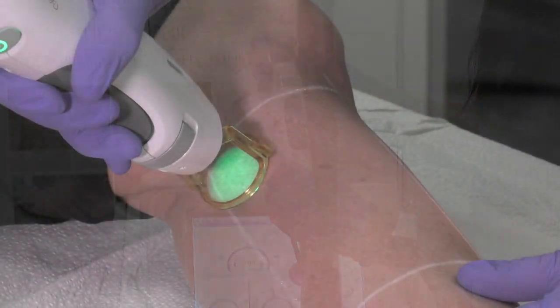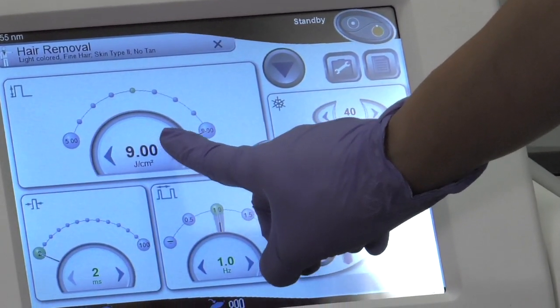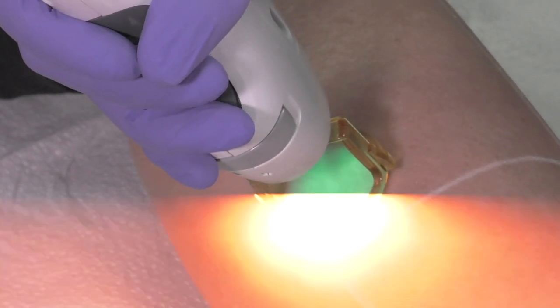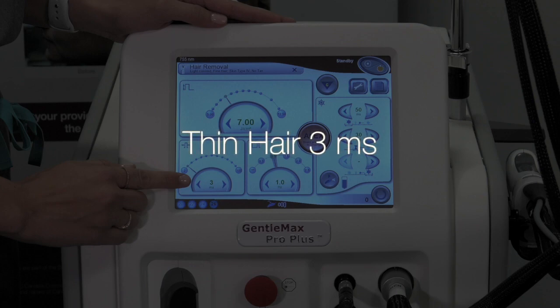You may perform test spots at the recommended settings, adjusting parameters until you reach a clinical endpoint of perifollicular edema or erythema. Remember that pulse durations should match the thickness of the hair. Thick hair should be treated at 10 milliseconds. Thin hair should be treated at 3 milliseconds. And finer, more resistant hair can be treated at a 2 millisecond pulse duration.